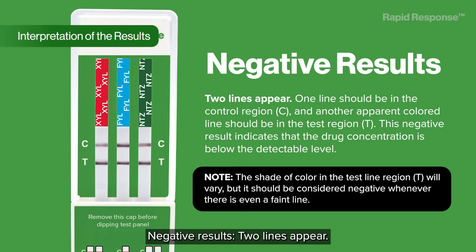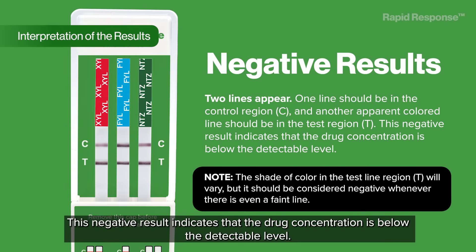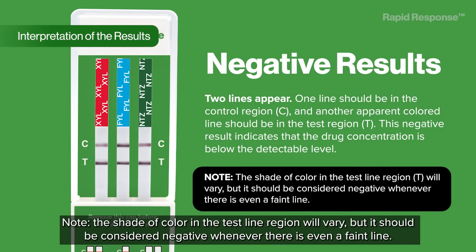Negative results: two lines appear. One colored line should be in the control region, and another apparent colored line should be in the test region. This negative result indicates that the drug concentration is below the detectable level. Note: the shade of color in the test line region will vary, but it should be considered negative whenever there is even a faint line.